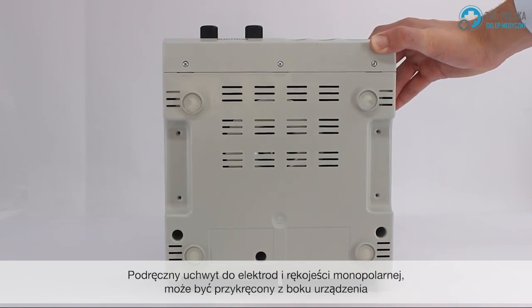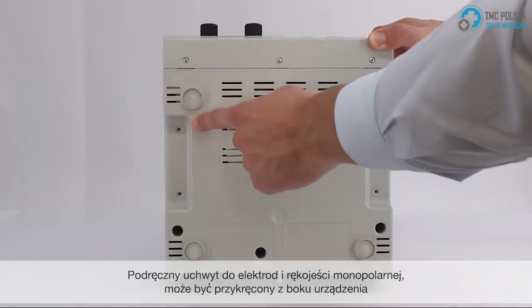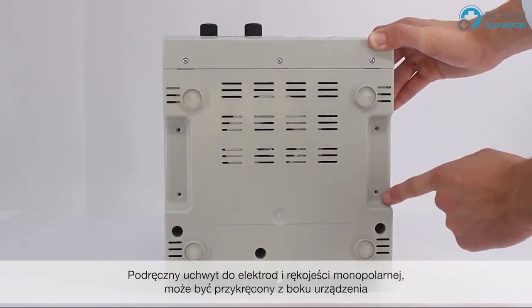Your electrode and active handle holder is placed at the side of the device and screwed in.